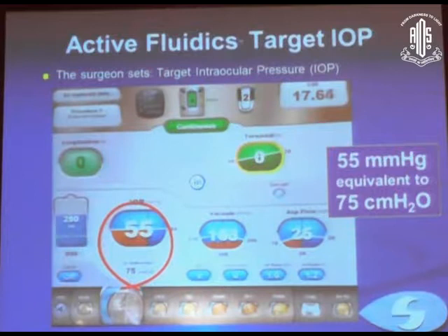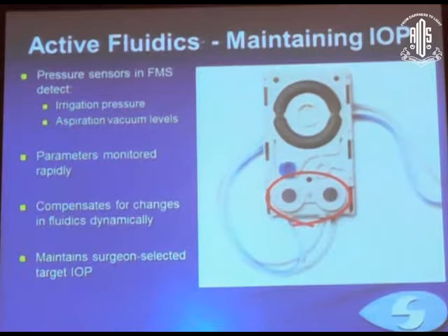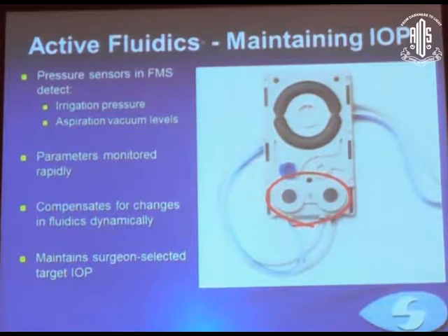The other way by which this machine maintains IOP is by having pressure sensors. The irrigation pressure and the aspiration pressure sensors are there. And it also maintains, all the time, the selected targeted IOP, as I showed you.